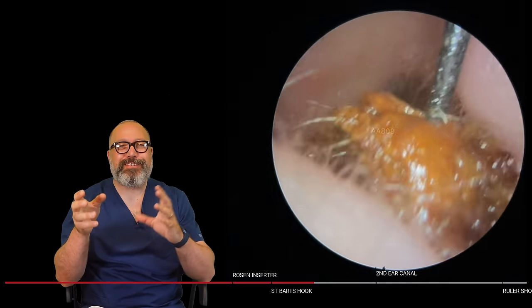There we are, just coming down. Out we go, there we are. Nice big chunk again. My goodness me, I'd forgotten just how much wax was in this. And don't forget, this is still one ear canal. This is not two ear canals so far. This is just still the first ear canal. So it's coming away really, really well. Now it's starting to break down.